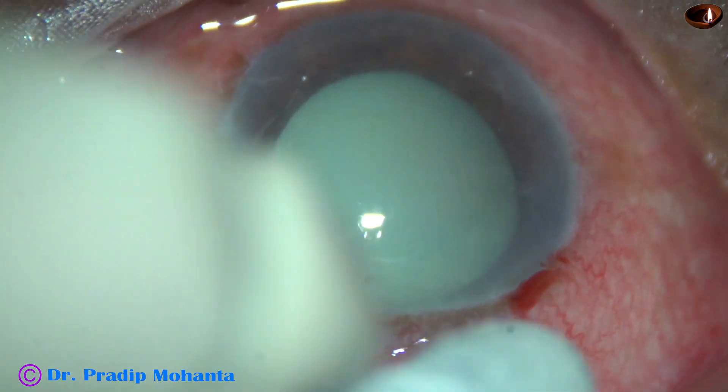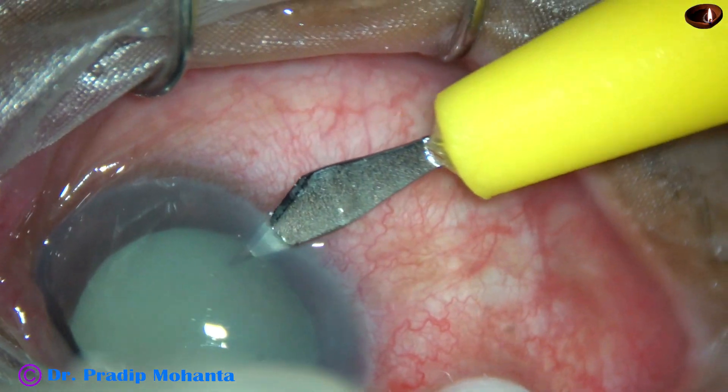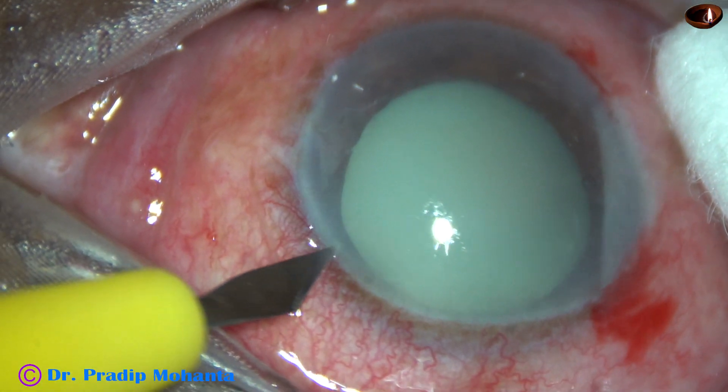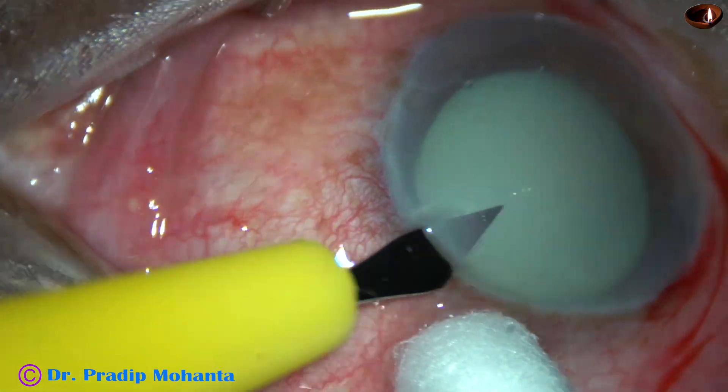The main incision has been placed. This is a side port on the right side of the main incision, about 3 o'clock hours away. This is another side port on the left side of the main incision, about the same distance away.